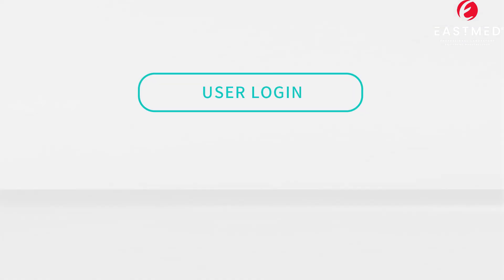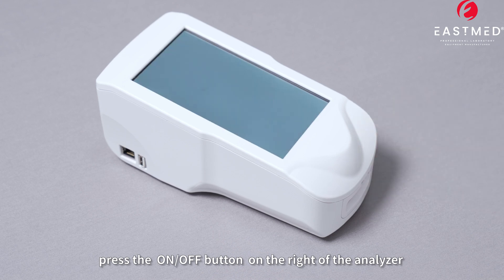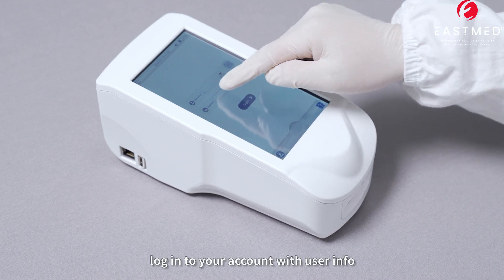Step 1: User Login. Press the ON-OFF button on the right of the analyzer to turn on the analyzer. Login to your account with user info.